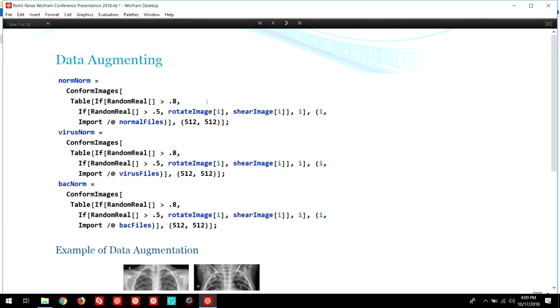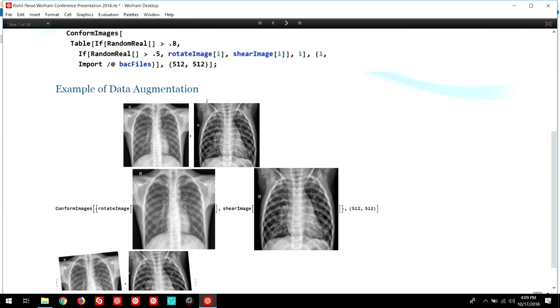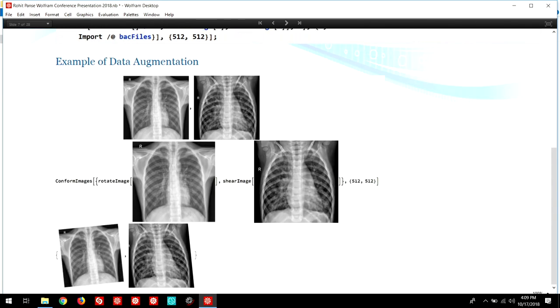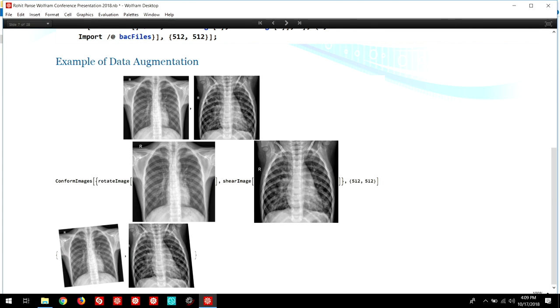Later, I adjusted the way I conformed my images by augmenting the dataset to improve my neural net. By altering the dataset, my neural net would become adapted to a greater variety of images. I made 40% of the images undergo a rotation via rotate image, and I made another 40% of the images undergo a perspective transformation via shear image. An important idea to consider is that your neural net is only as good as the data that you feed it. By augmenting the data, one can prevent the neural net from learning irrelevant patterns, and thereby improve the accuracy. Here you can see a sample effect of the random transformations and its effect on the images.